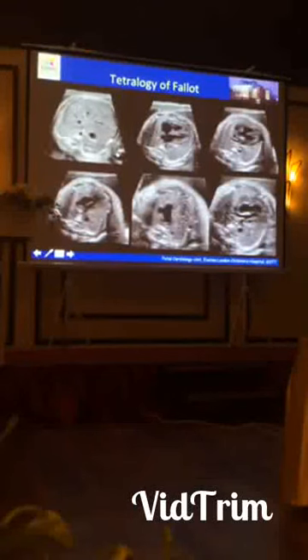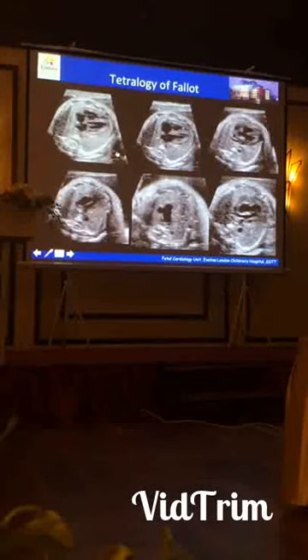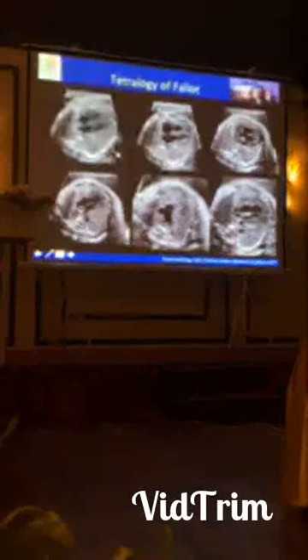So just doing a sweep here. So from abdominal situs, which is normal. So going down to the abdomen, aorta, IVC, stomach here, apex here. This is left, this is right. So coming from abdominal situs up to the four-chamber view. Then from the four-chamber view, start angling up towards the aorta, and we start to see the VSD, and we can see the override.